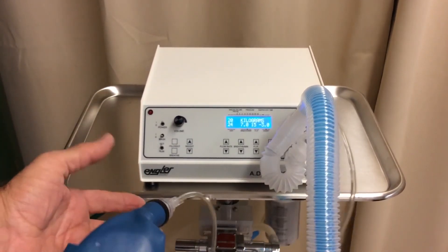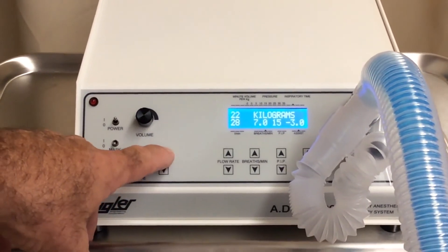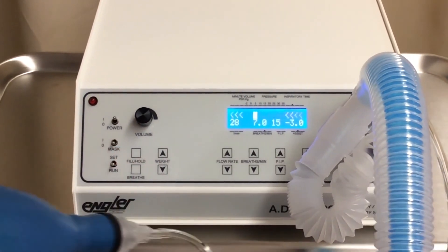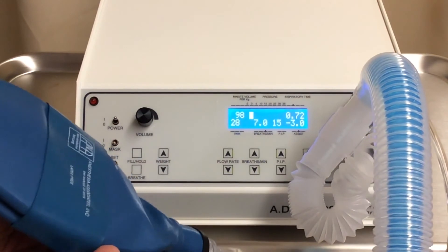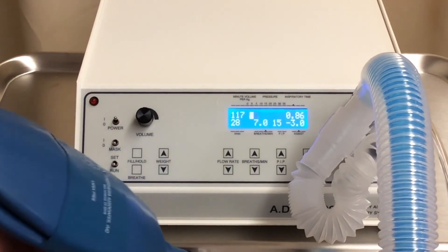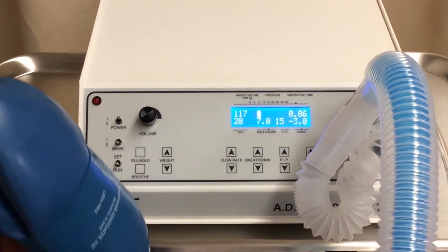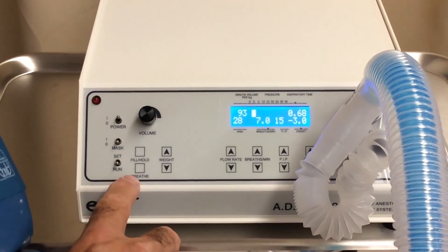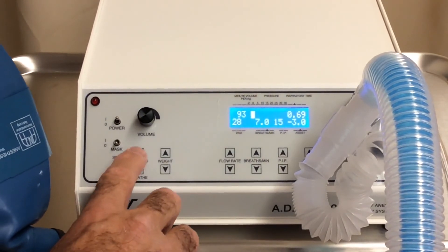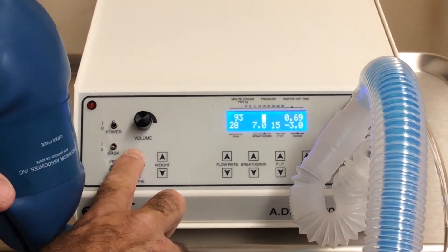Now we have to set the weight, and we do this by just pushing a button up here, either up or down. In this case, we're going to push up. We're going to go to 24 kilograms for this patient and turn it on. We are now ventilating and delivering anesthesia to our patient. If you need to change any of the breathing parameters, you can do that manually at any time — you have the flow rate, breaths per minute, and peak inspiratory pressure, which can be changed any time during the surgery. We have a breathe button, which allows you to manually deliver a breath any time. We also have a fill and hold button, which will fill and hold the lung to the peak inspiratory pressure you have set and maintain it until you let go of the button.